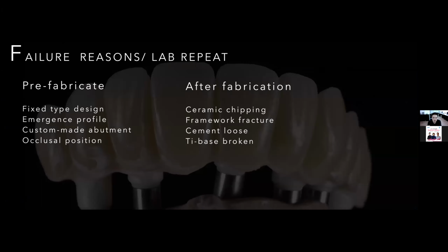And when we start today's webinar, first I want to talk to you about how the problems happen. We have two stages where problems happen with the implant restoration. One is the prefabrication, when we make our implant restoration before sending this case to the customer. We have many problems and points we need to take care of in our laboratory.